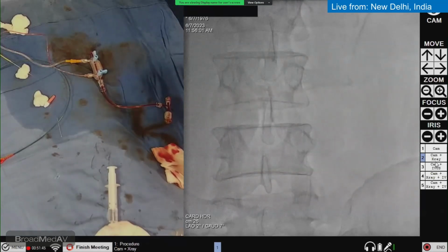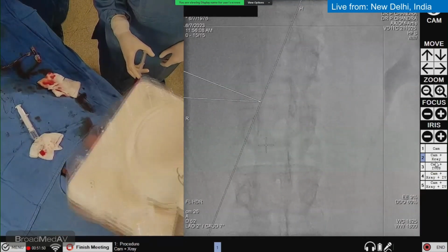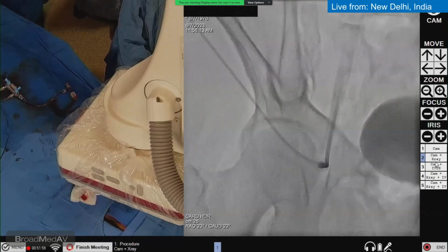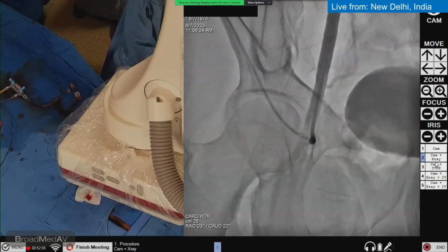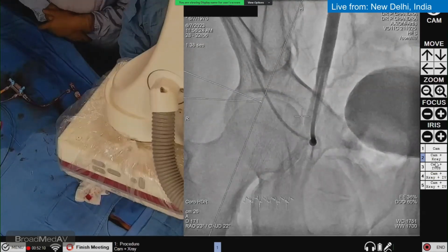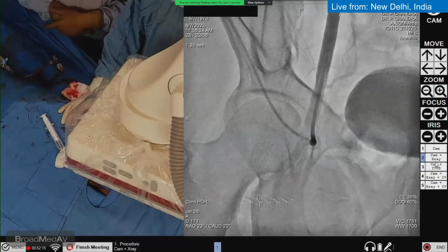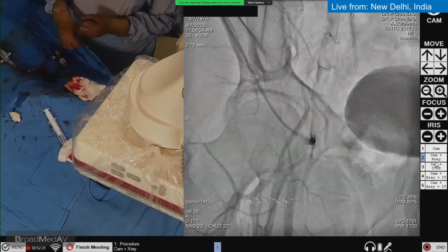RA caudal. Okay. Take a shot. I think in this it is clear that the puncture is above the bifurcation, right? Because it was overlapping in the other view. And we can even do angioseal. So give me angioseal, please.